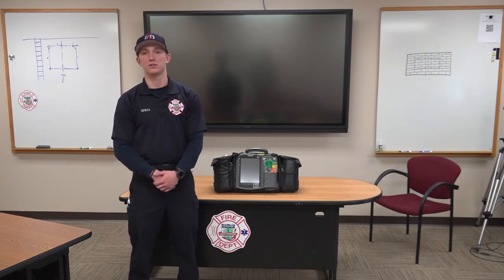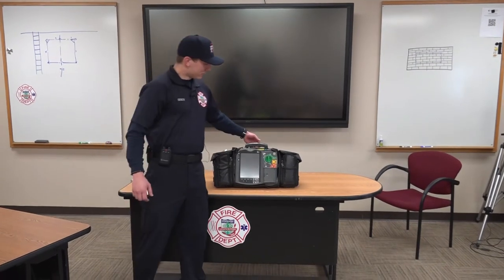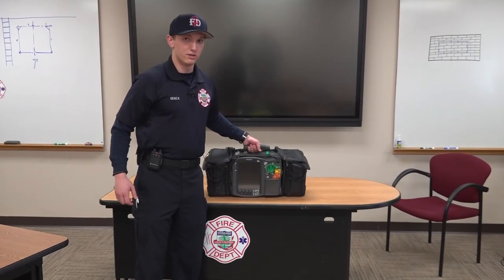Hi there, my name is Joey Giamza. I'm a firefighter paramedic with the Stevens Point Fire Department. Today I'm going to be showing you our new Tempest monitors. This actually is not our monitor — these are our old monitors.